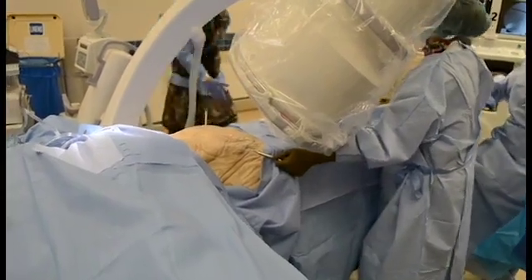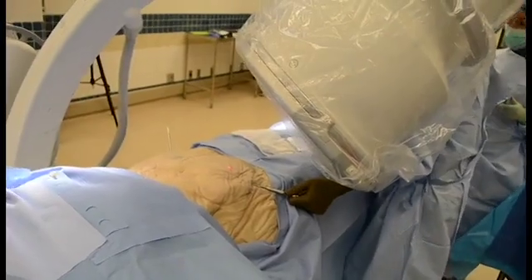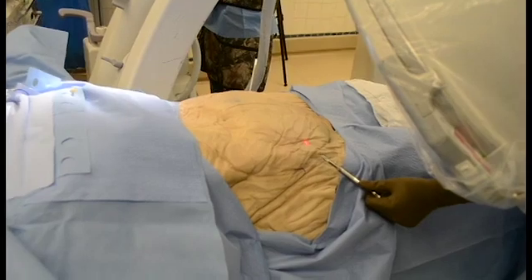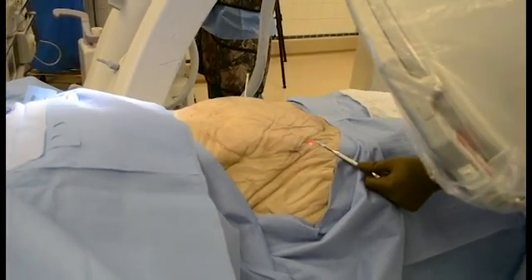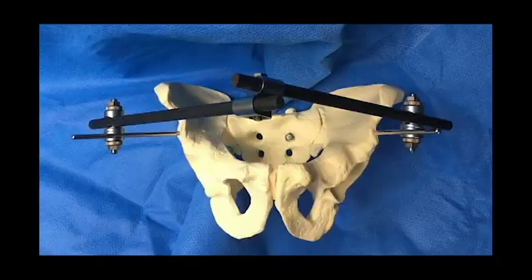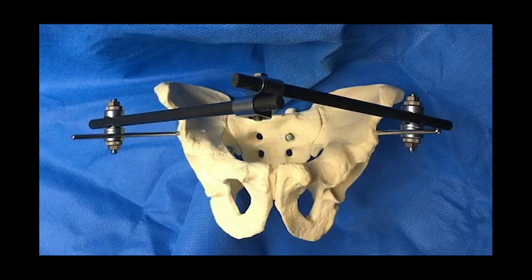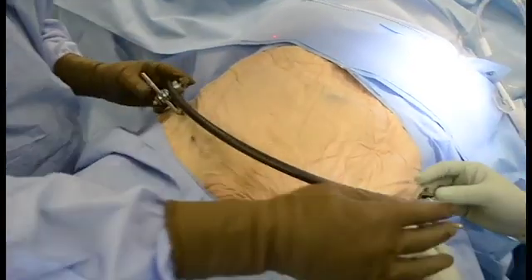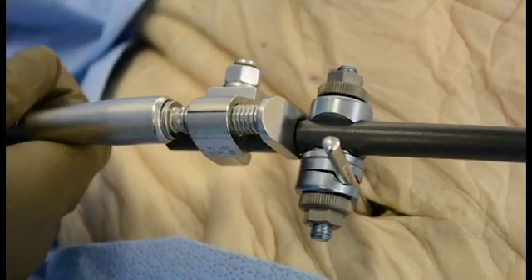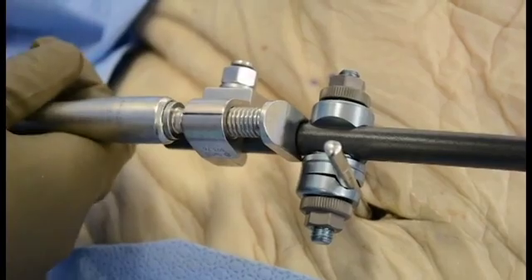Repeat on the contralateral side. You may consider moving the C-arm to the other side so it is not in the way and to reduce surgeon radiation exposure. It is helpful to have a table that tilts for ease of intraoperative views. Following pin placement, place clamps on the outside of the pins for better compression through the pelvis. Secure with two connecting rods with adequate room for the abdomen when the patient is seated, as well as room for swelling to prevent skin necrosis. You may also use a curved pelvic-specific rod. The compression-distraction device can then be used for additional pelvic reduction if needed.